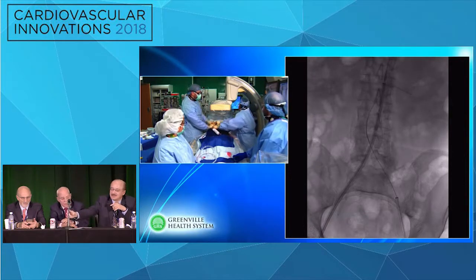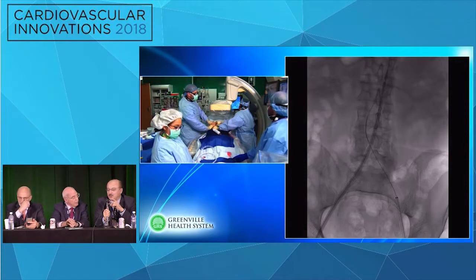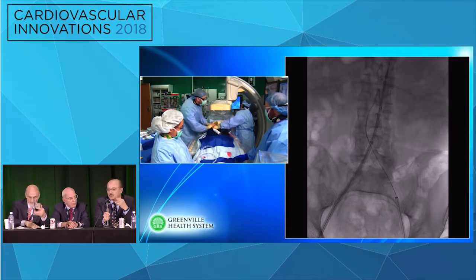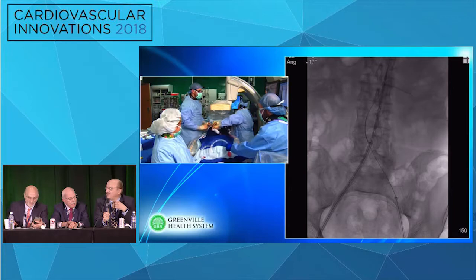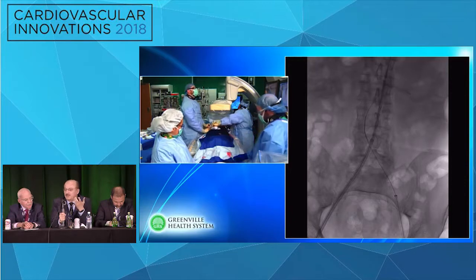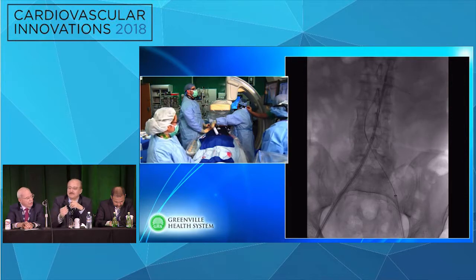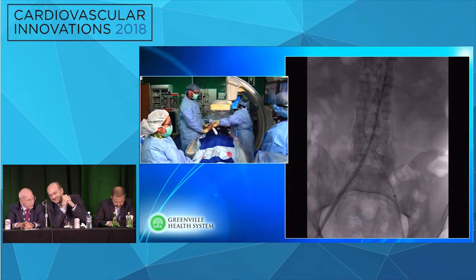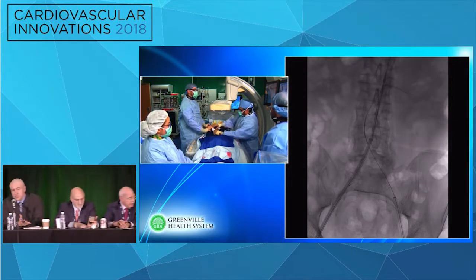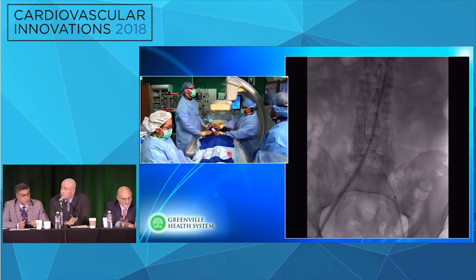Thank you, Munir. And then Steve, do you have any thoughts after Munir? So really, I use IVUS in aneurysm only if there's a suspicion of a problem in the neck. That's the only time. Because you are wasting $1,800 in a case. This is a lot of money. And when we started learning about IVUS, we used it, but we found it did not make a difference at all in the procedure with a very good CAT scan. Anatomically, this is a great case for any device on the market. So I don't know about the utility of adjuncts like IVUS, but I think it's a great instructional tool today. But to be honest, I probably would not have selected that for this particular anatomy.